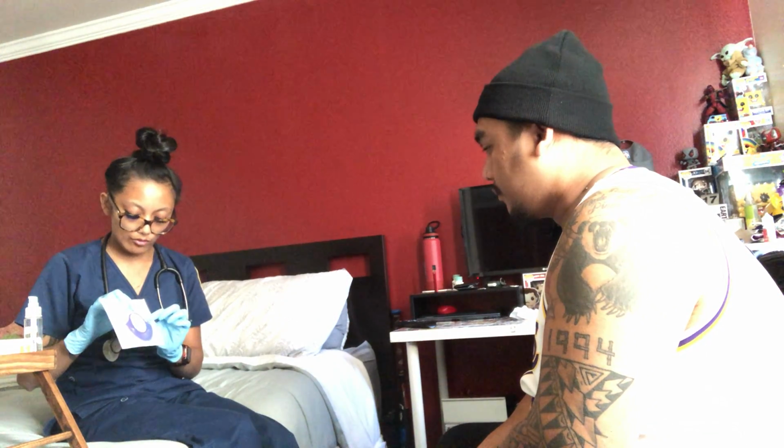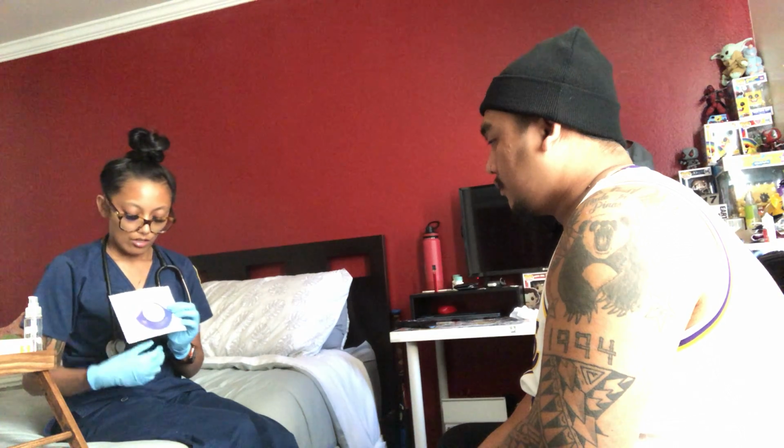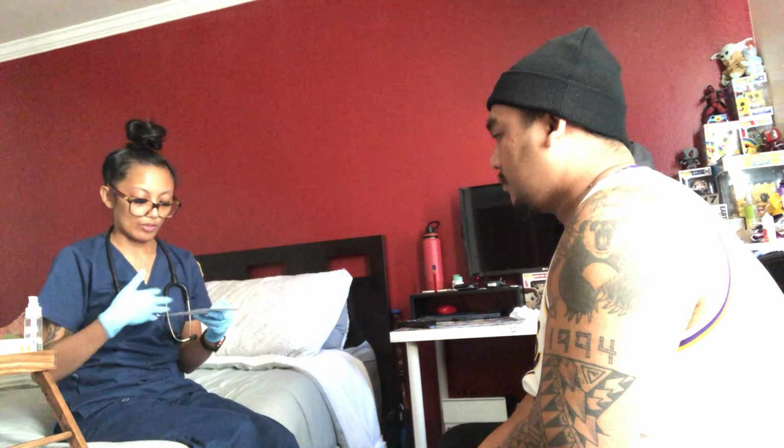Okay. So for this one, you're going to have a counter for how many doses are still left in here. This one is a powder. It's going to be kind of the same way as taking the other one, except this is going to need a swifter breath in, and this one you're going to have to hold for 10 seconds as well, and then breathe out very slowly so that you don't let any of the medication leave your airways.